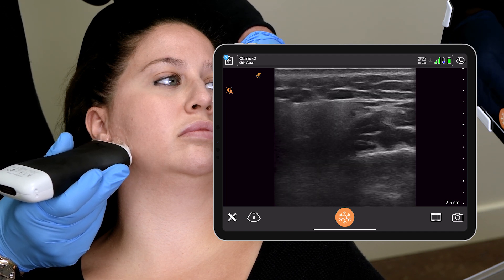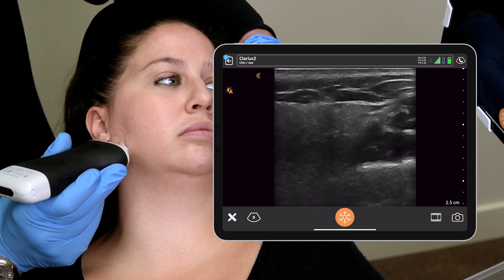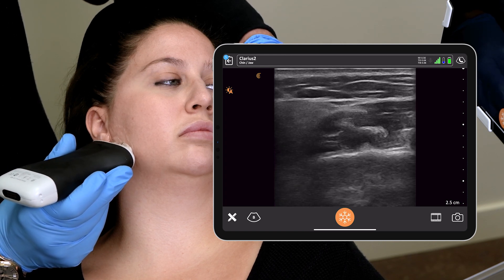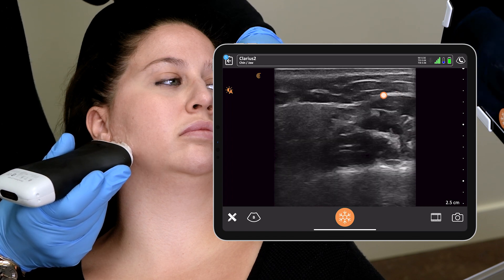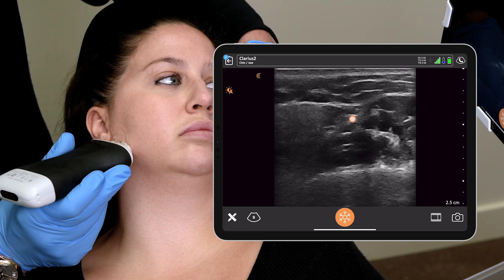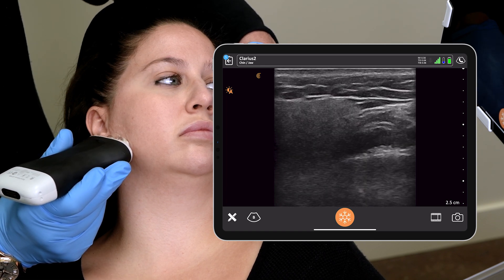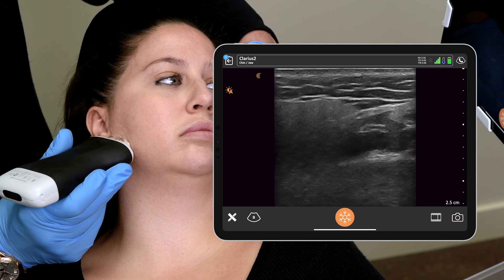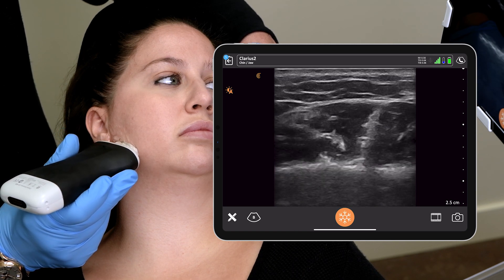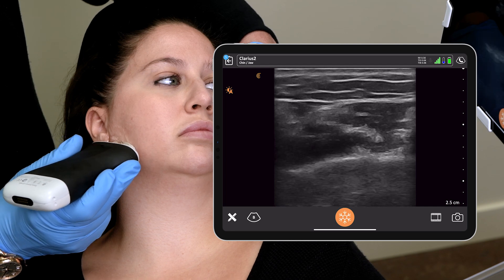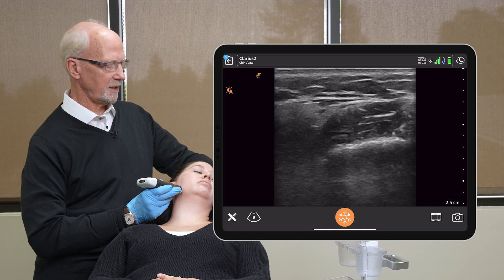There's a tremendous interplay between these two structures. Have the patient clench their teeth, then relax. You can see that little bulge of the masseter and how it pulls the parotid forward a bit. You can see the parotid fascia, which is very thick, and how it incorporates into the fascia overlying the masseter — which we'll look at in a little more depth in a minute.